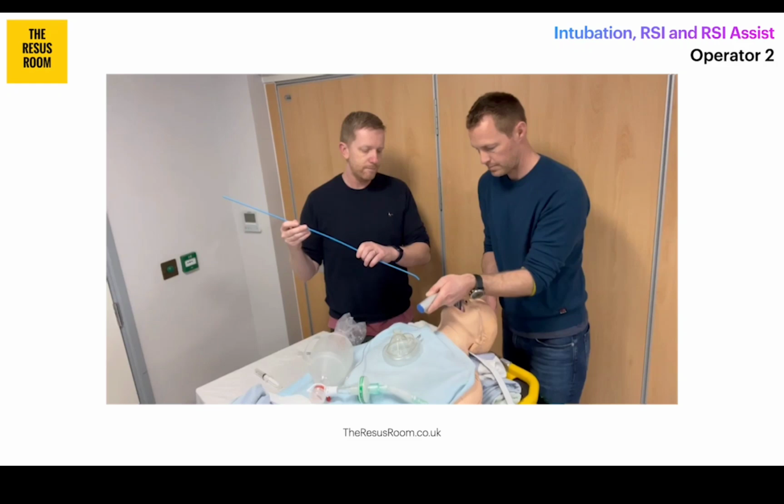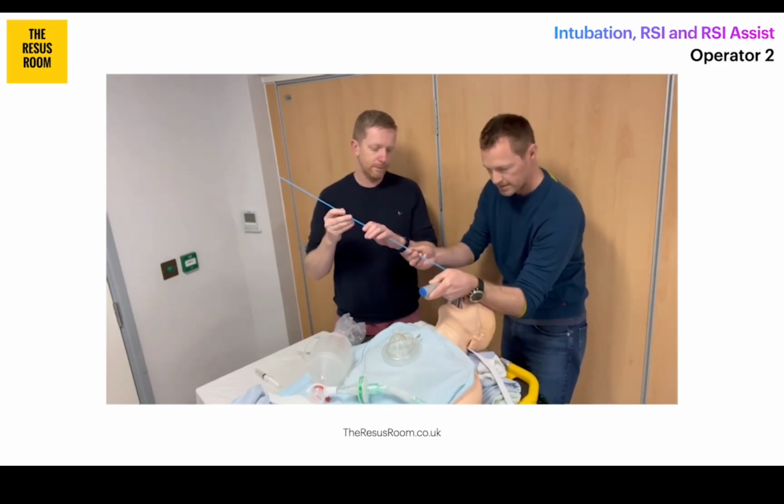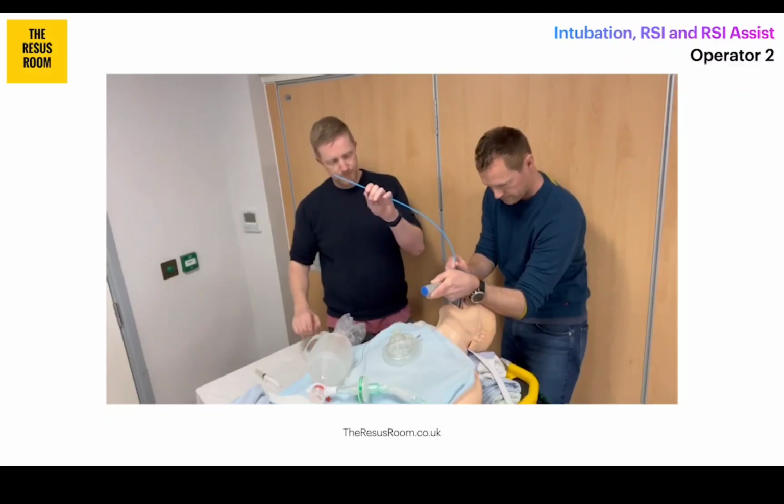Right, so at this point, Simon knows that I need to keep my eyes on the glottis and not look away. So he slid the bougie really beautifully right into my line of sight, close to the patient's face, so it remains in focus for me, and that means I've got no issues taking a hold of it and using it.